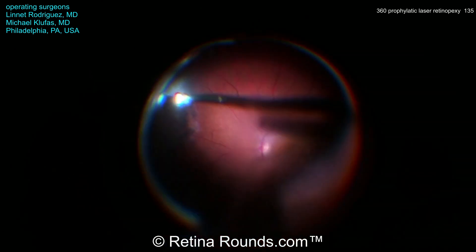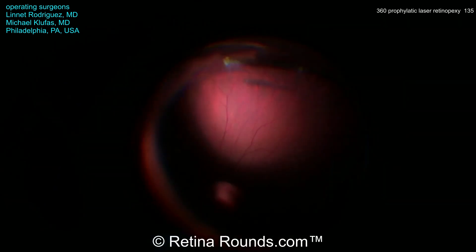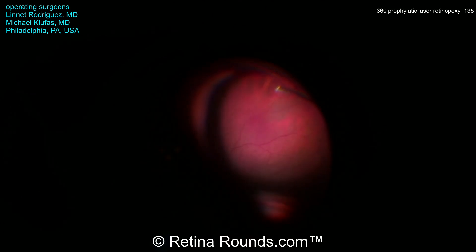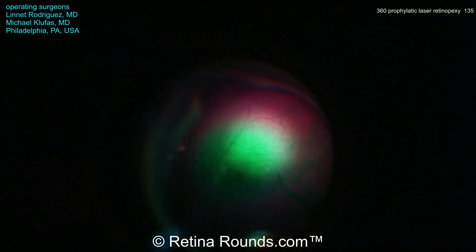At this point in the case, Dr. Klufus as well as his fellow Dr. Rodriguez are performing a core vitrectomy to remove those symptomatic floaters and are performing a limited peripheral shave at this point without any scleral depression.